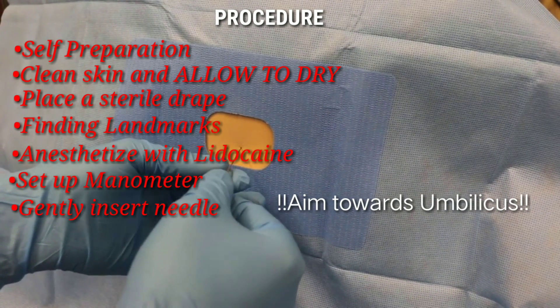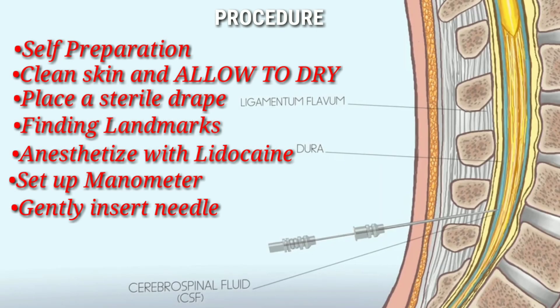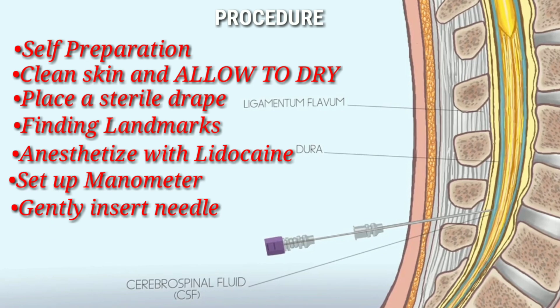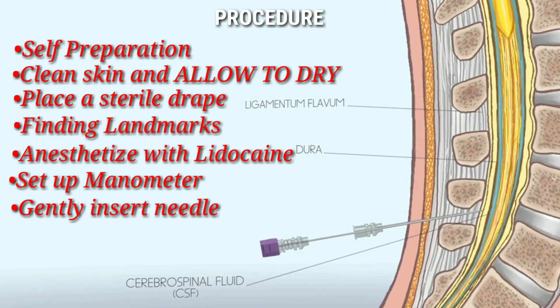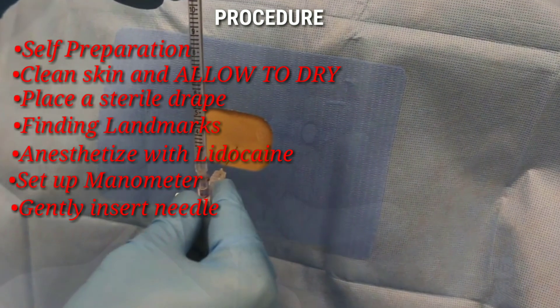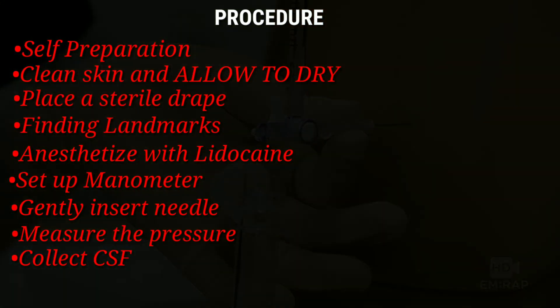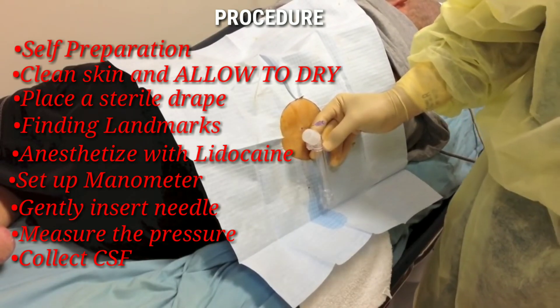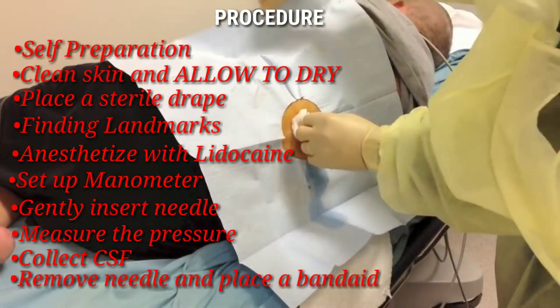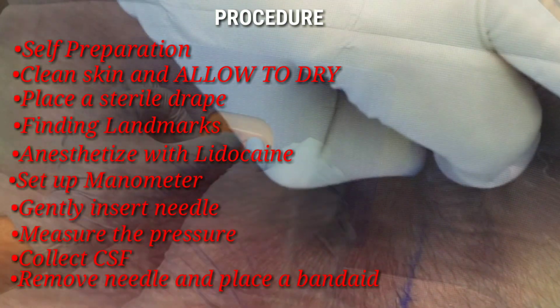Make sure you cross the supraspinous ligament connecting the spinous processes and penetrate the ligamentum flavum connecting the laminae of adjacent vertebrae — you may feel two pops. Remove the stylet intermittently to check for CSF, as you do not always feel those pops. Once CSF appears, use the manometer to measure the pressure, then turn the three-way stopcock open to collect the fluid into three separate collection tubes at its normal speed. Once done, remove the spinal needle and ensure no CSF is leaking. If it is, pinch the skin and apply a bandage pulled tightly across the wound.